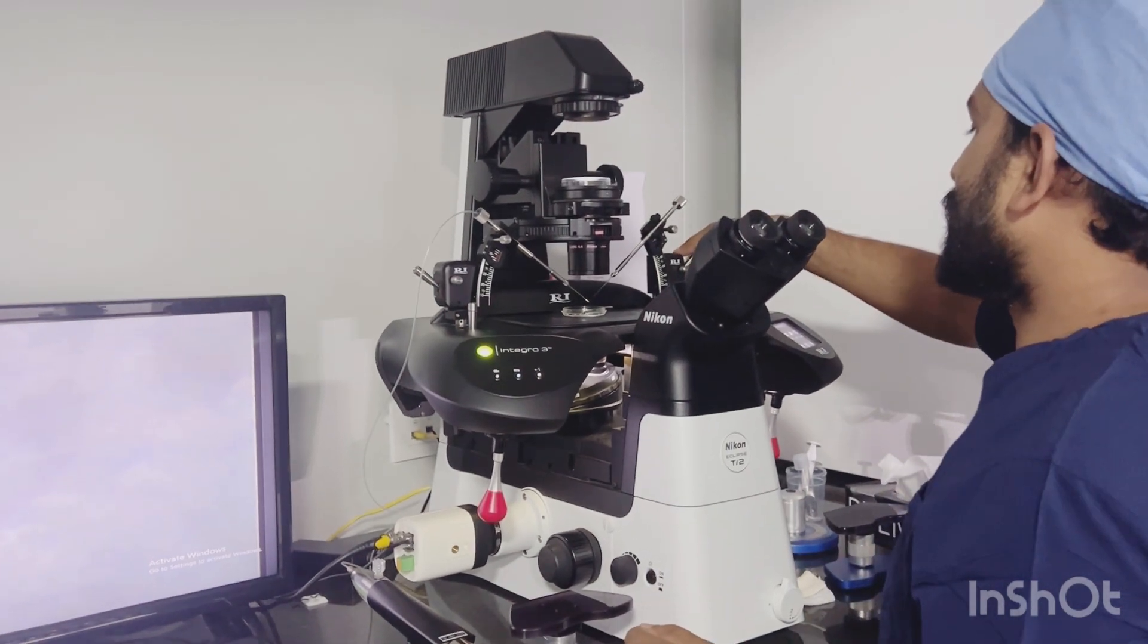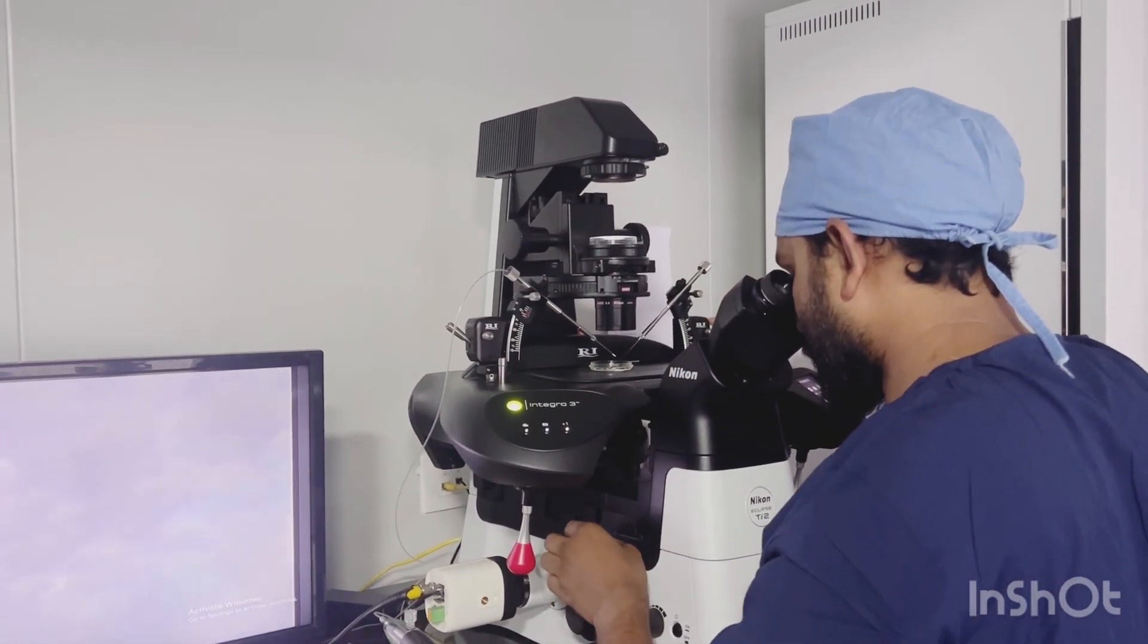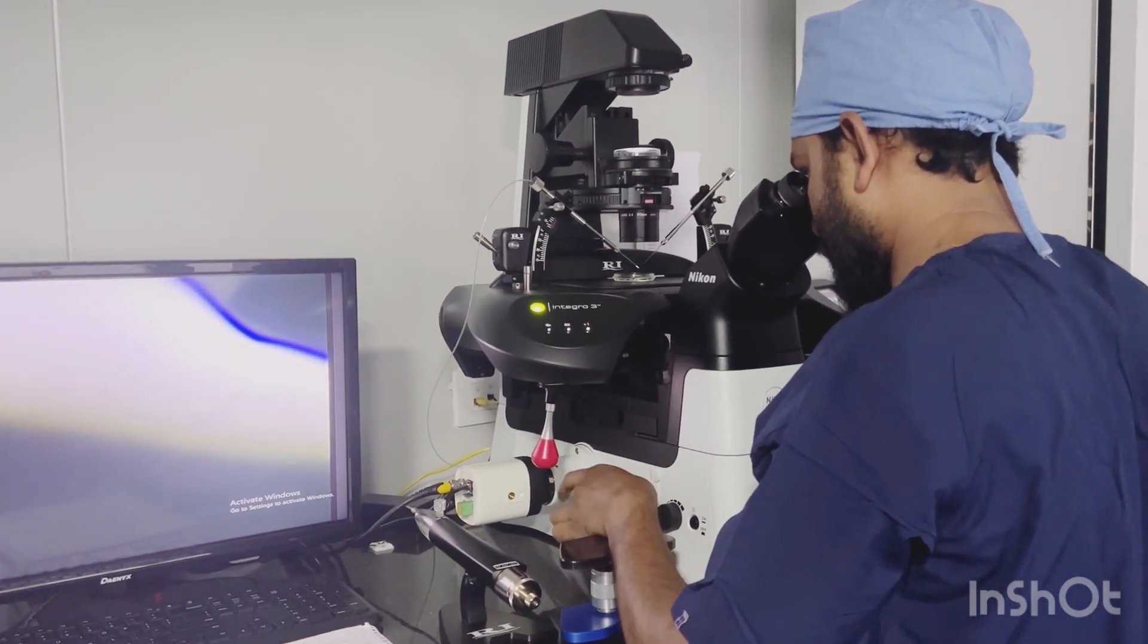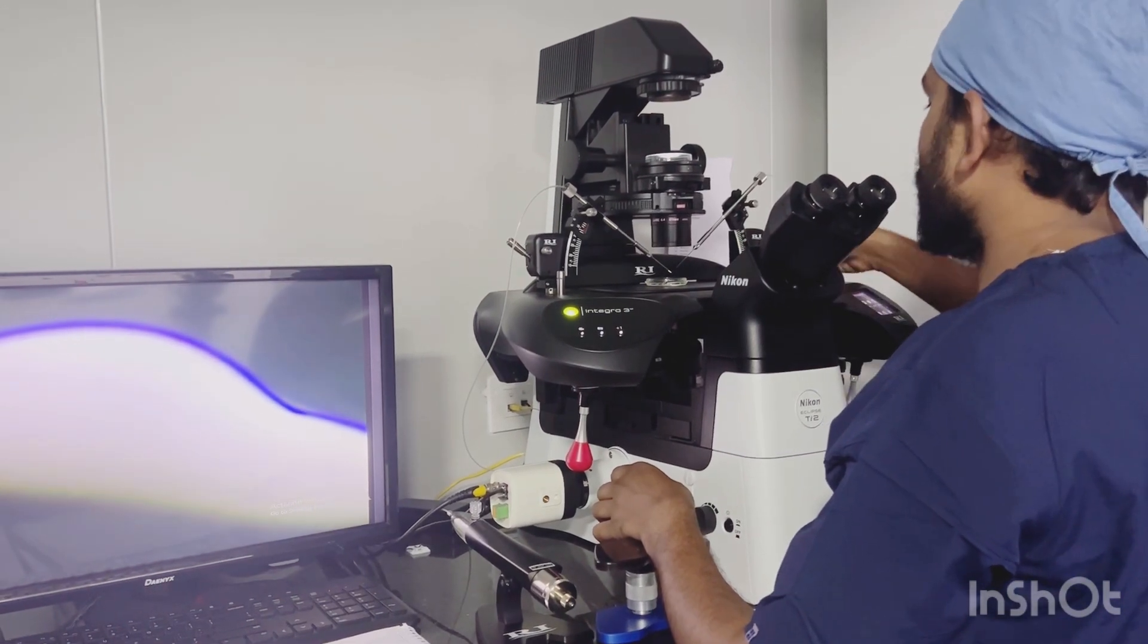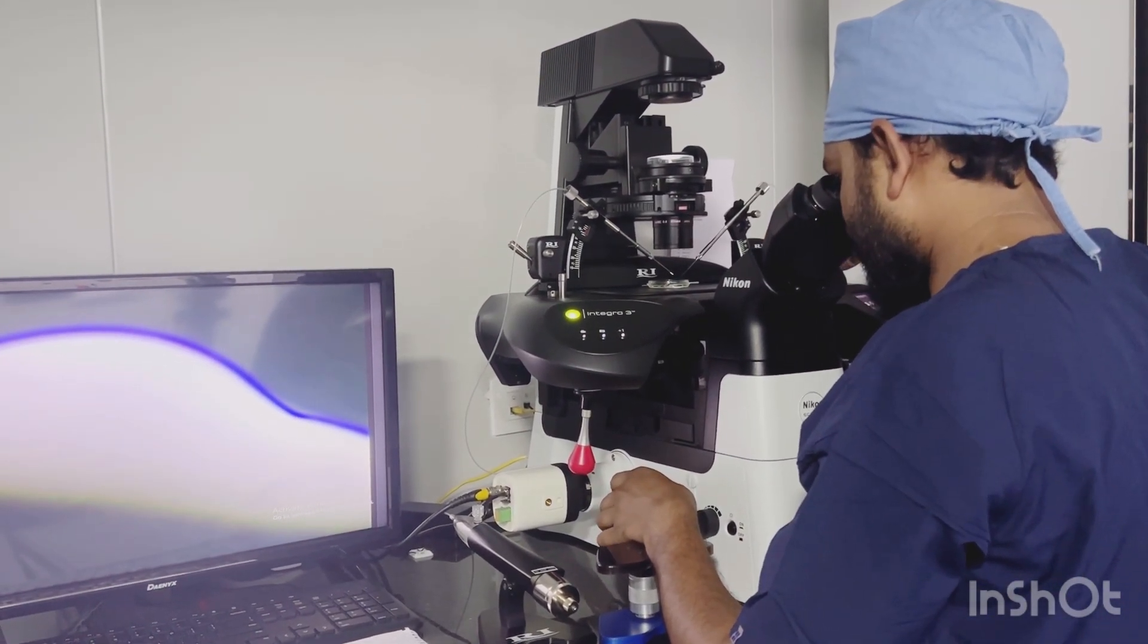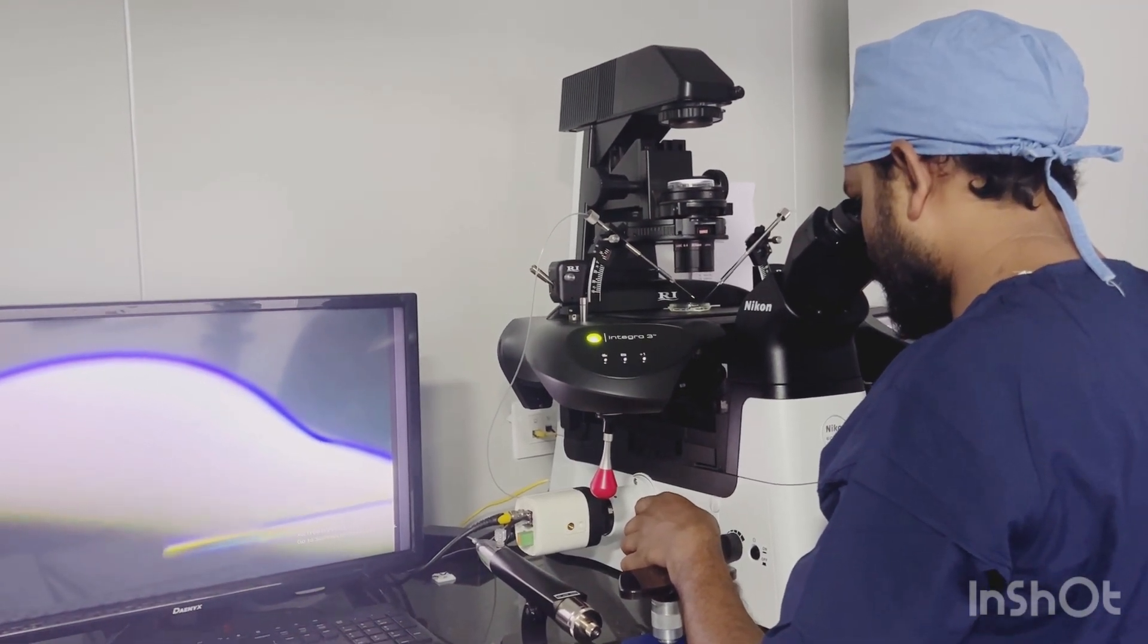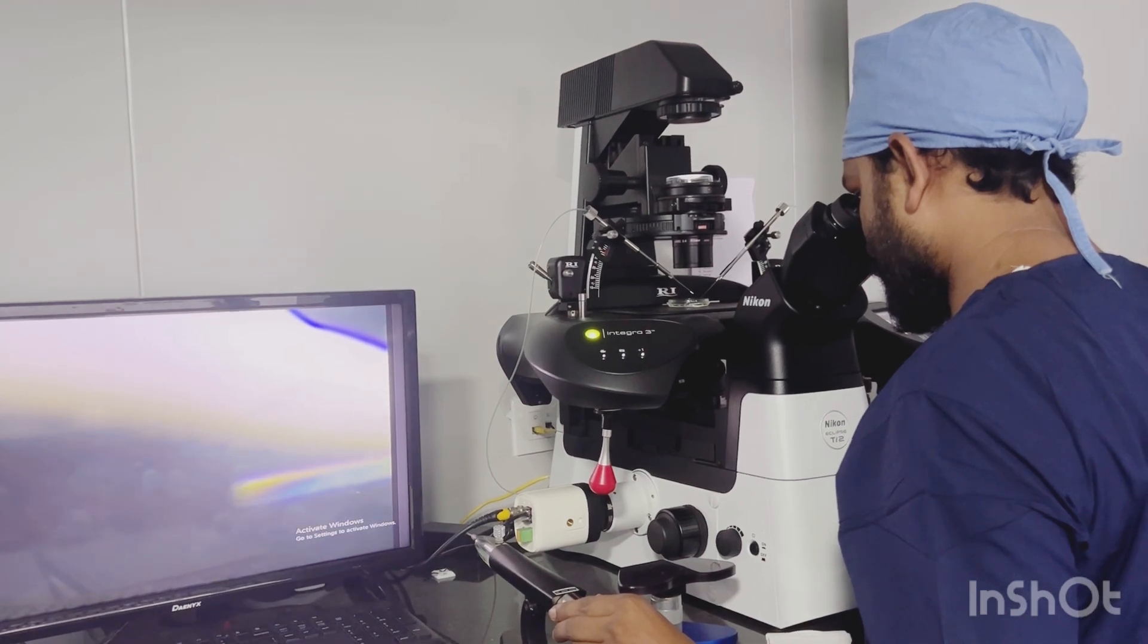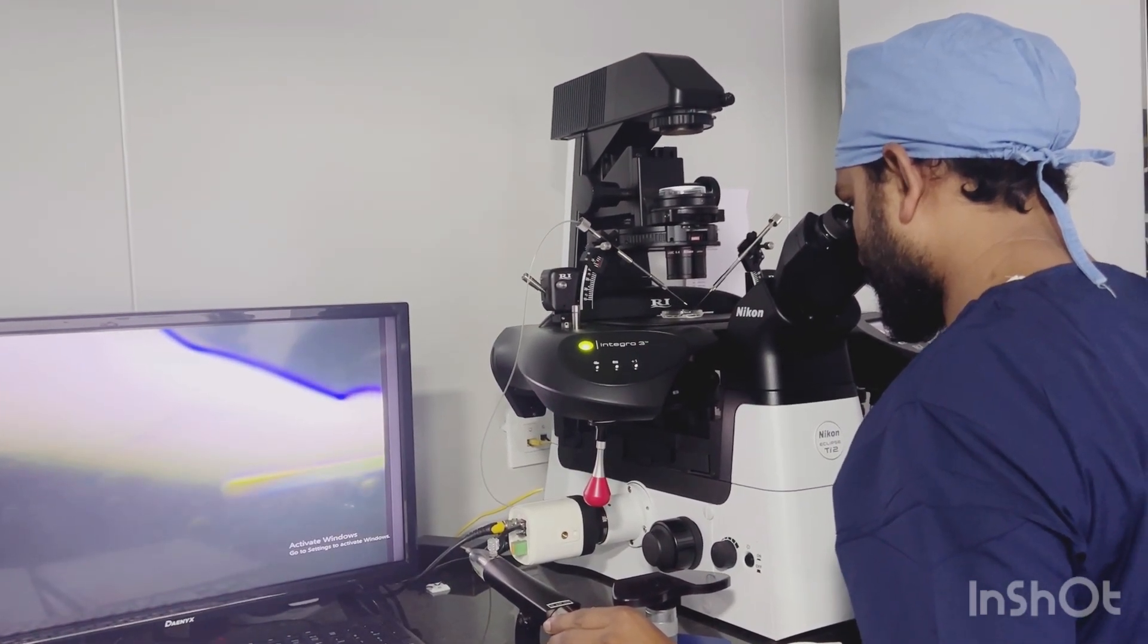Then we have to lower this lever. At the 4x, we can see our PVP drop. We lower our injecting lever - this is our injecting pipette.